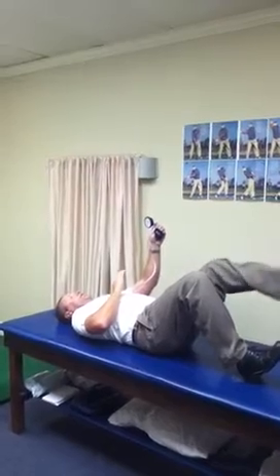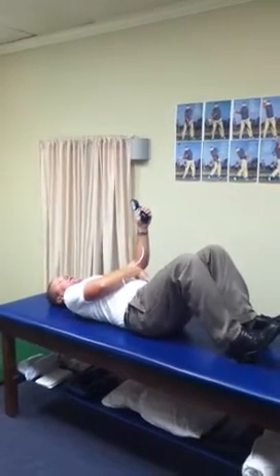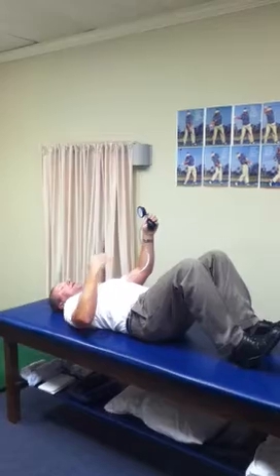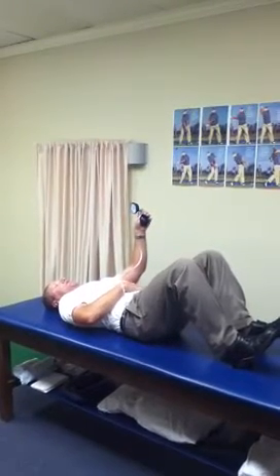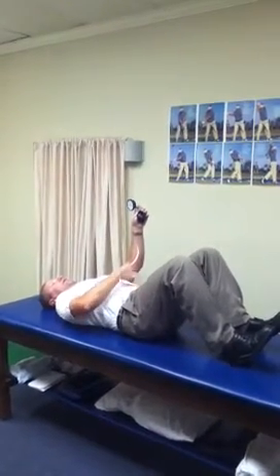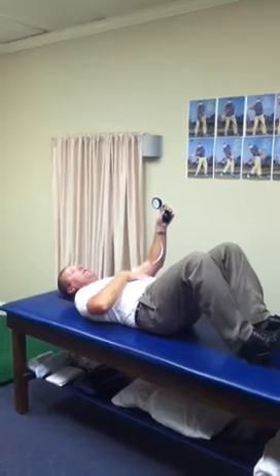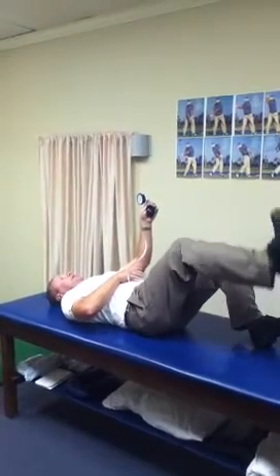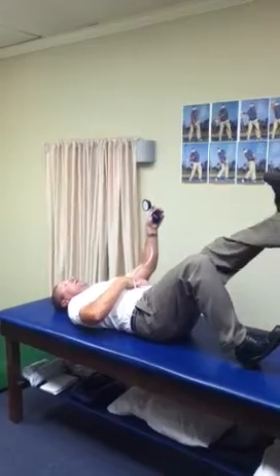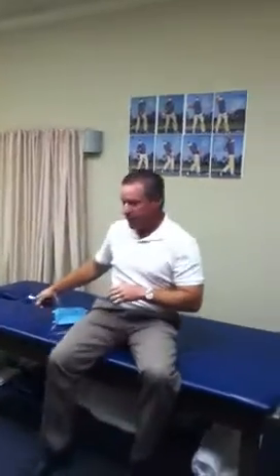40 is a little bit of an arbitrary number — it really doesn't matter where you start. Sometimes I'll start at 70 if a person has more difficulty. But this is just training how to recruit the core. We're using a little bit of biofeedback because you have the visual cortex involved. You can also put your hand on your stomach to see if your stomach is raising — a lot of people are going to do this, and that makes the dial go way up, but it's not using the correct muscle. So abs have to be in, then you stabilize, and then you extend. That's a simple way to make sure we're using the right muscle, and we're going to apply that to the standing position in a few minutes. That's just a good basic way to train the core.